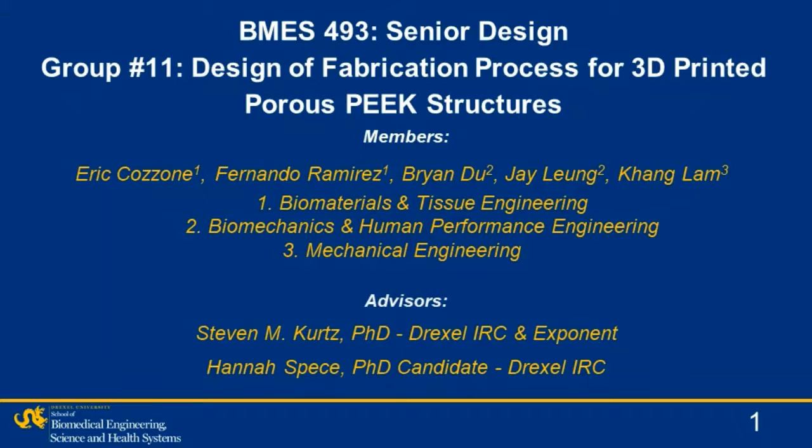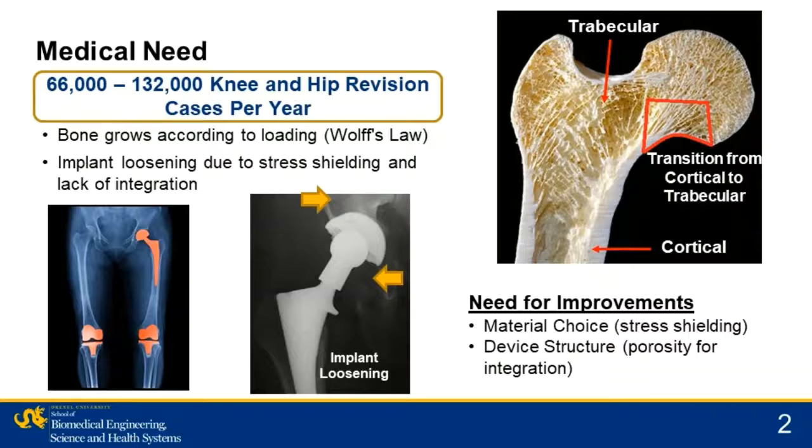Hi, welcome to our presentation on the design of fabrication processes for 3D printed porous PEEK structures. We're Group 11. There are up to 132,000 knee and hip implant revision cases each year.